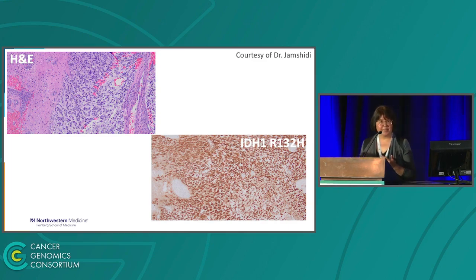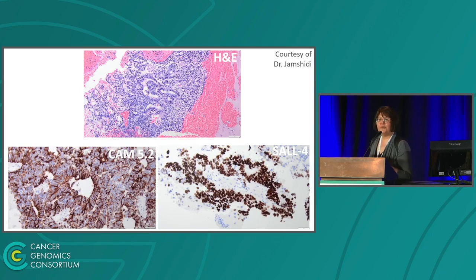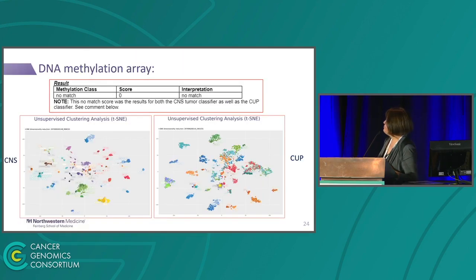The biopsy was very informative. So you can see that this is not glioma, this is not primary CNS, because you see this very nice rosette formation and very solid tumor growth. And most importantly, carcinoma markers were so strongly positive. We knew that we are dealing with metastasis of carcinoma of unknown primary. As you remember, the individual is 25 years old, definitely qualifies and fit for treatment, but treatment needs to be based on the tumor of origin. It's very important.